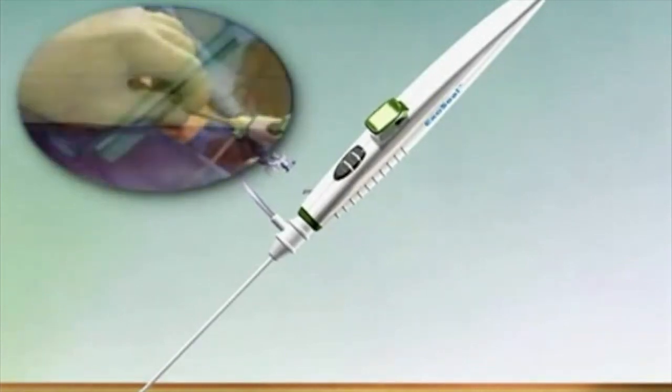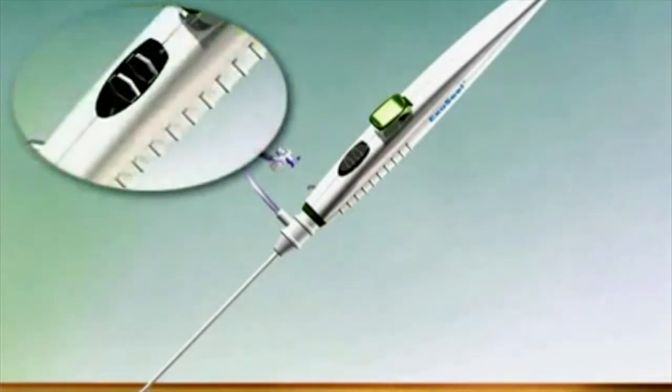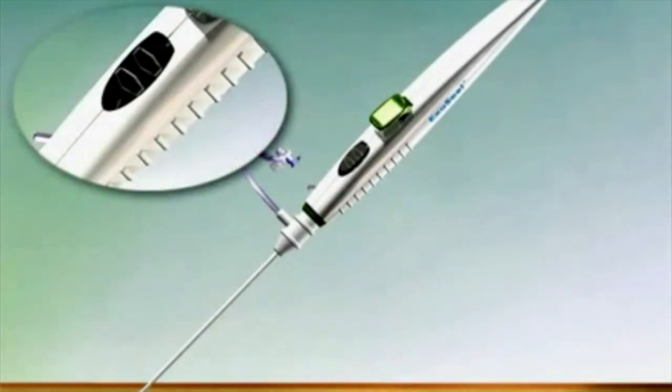Continue to slowly retract the ExoSeal vascular closure device and the femoral sheath until the graphics pattern in the indicator window changes from black and white to solid black.